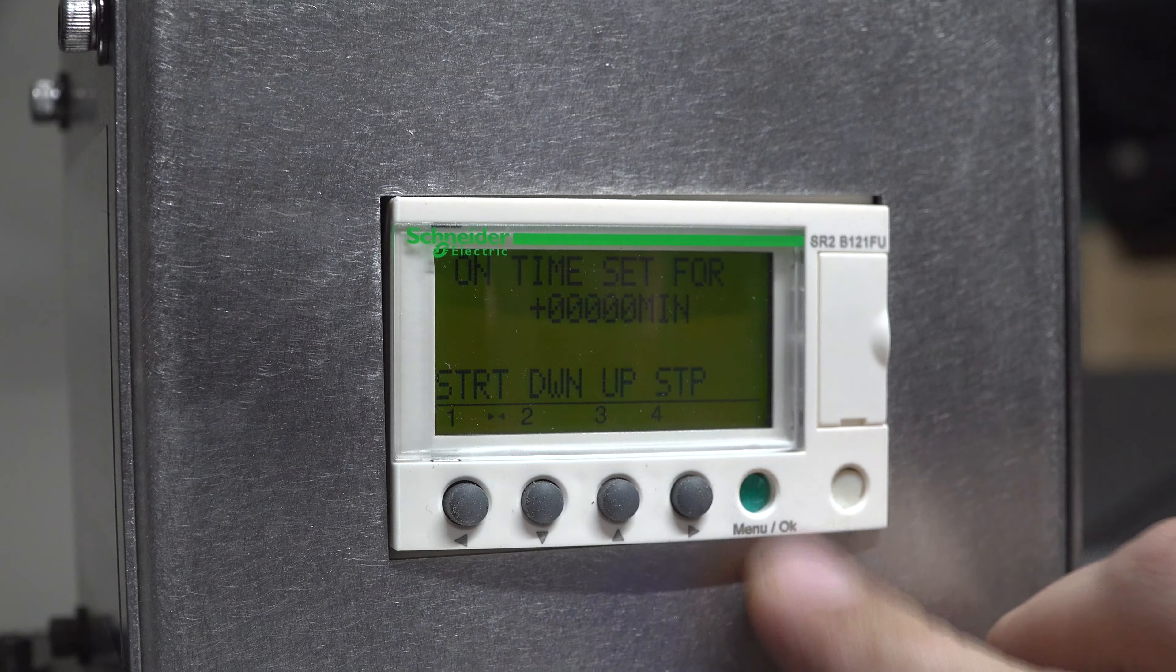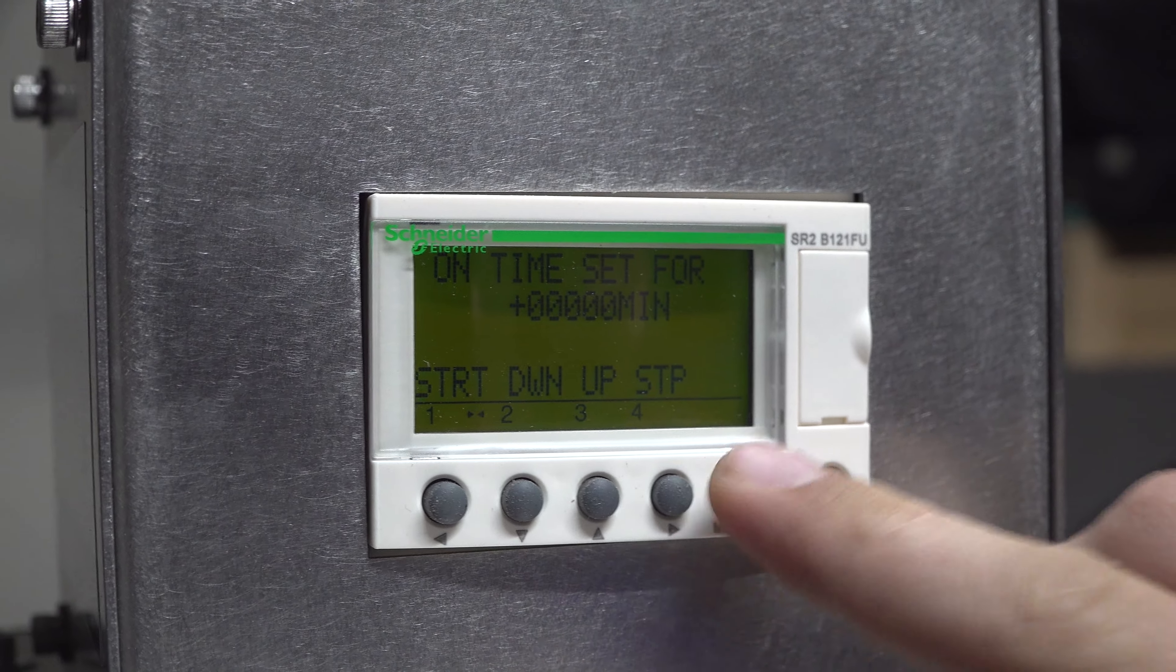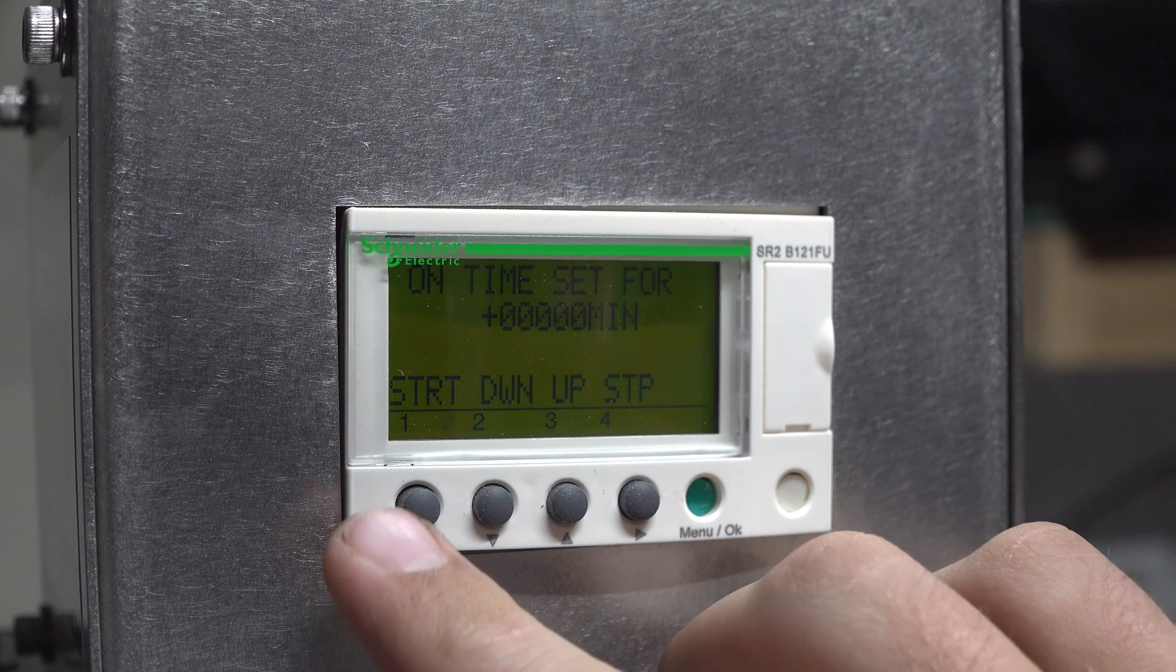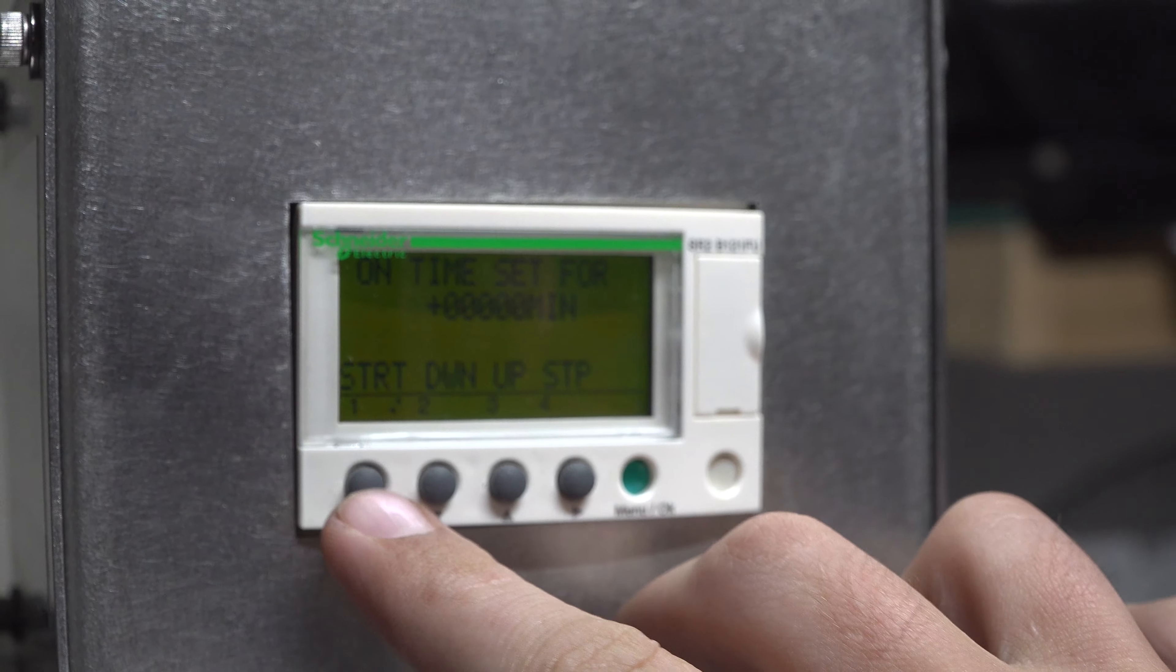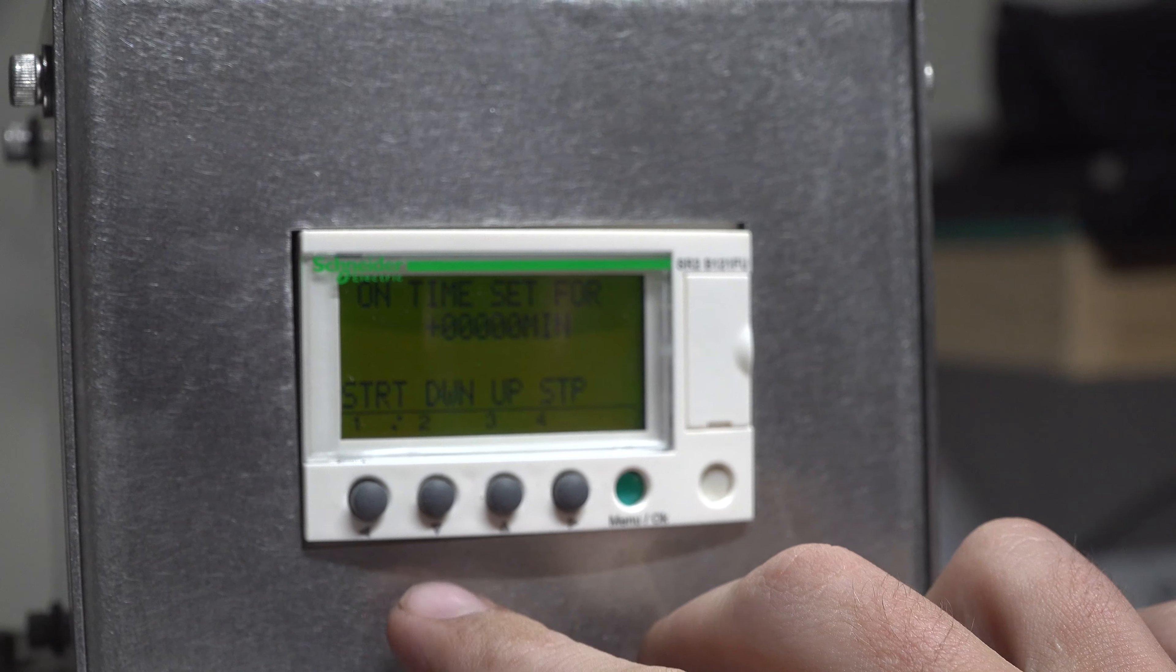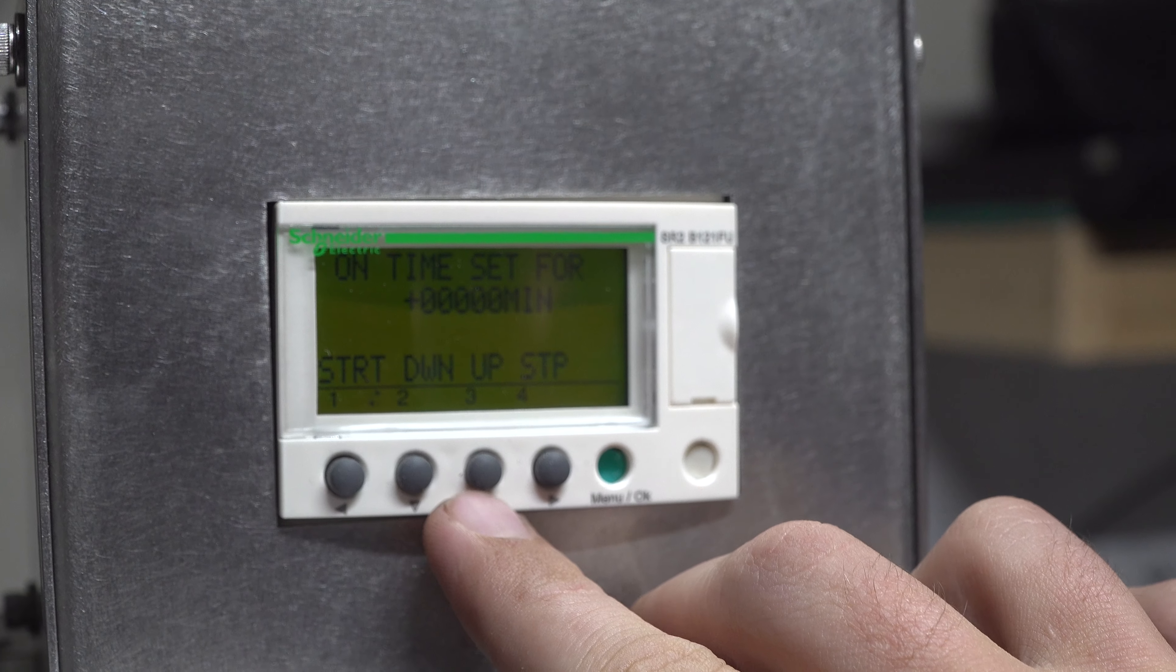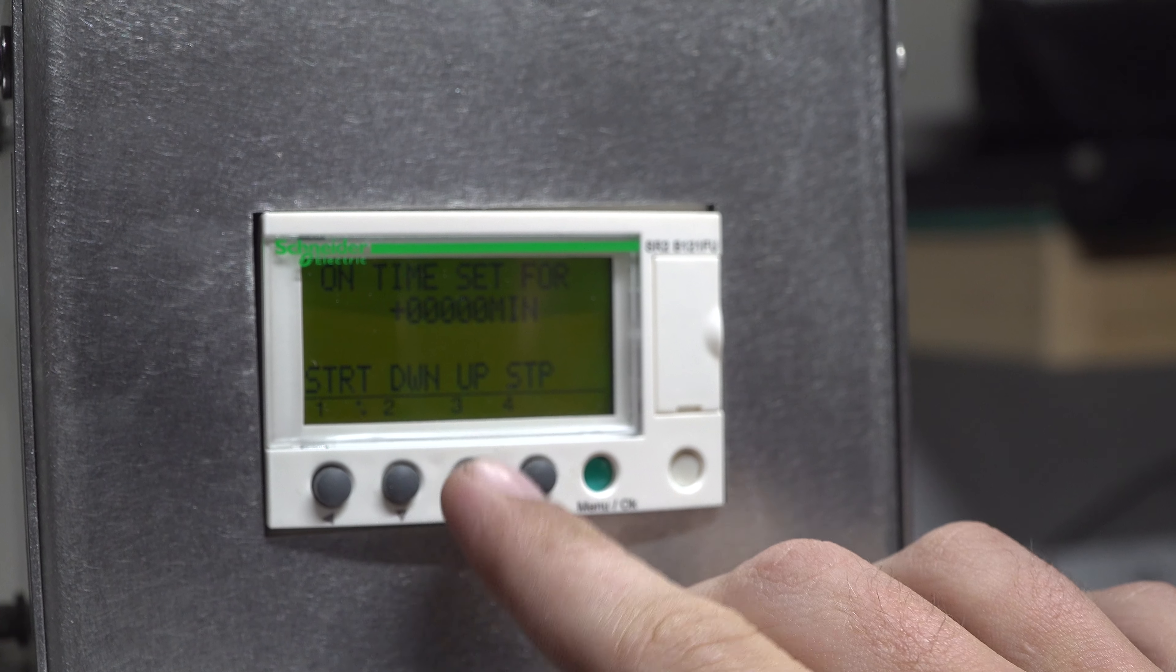They shouldn't be accessible to you under normal circumstances. These four are the main ones you'll see. They're labeled start, time down with a down arrow, time up with an up arrow, and stop.